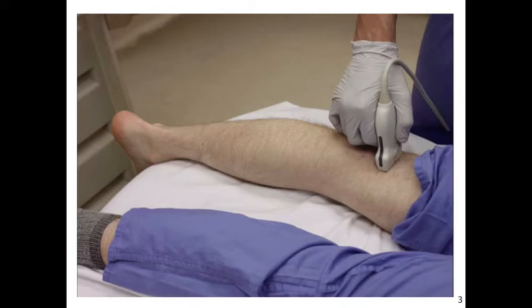A good landmark to identify initially is the popliteal artery, which is the deepest vessel. The popliteal vein should be superficial to this. Superficial to these vascular structures, you may see the tibial nerve. If you trace this nerve cranially, you may identify the branch point of the common peroneal nerve. This branch point is the optimal location to perform the block.